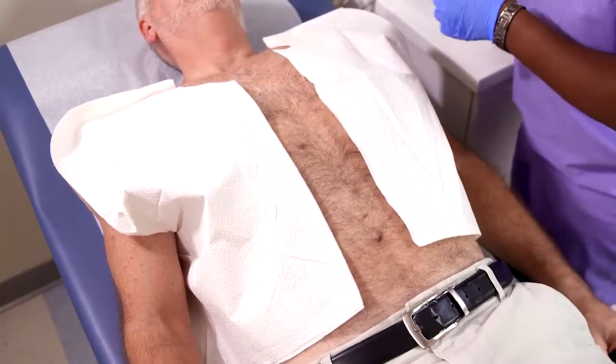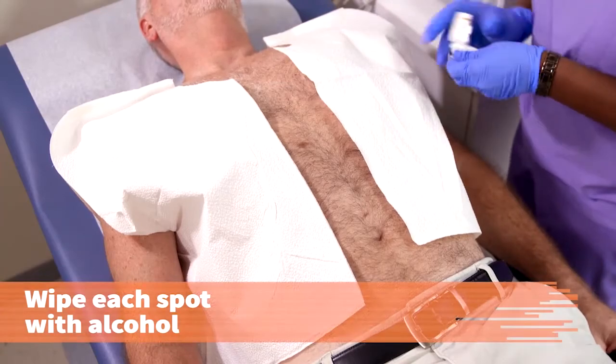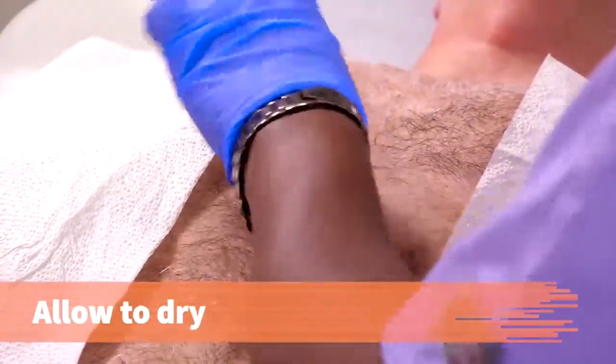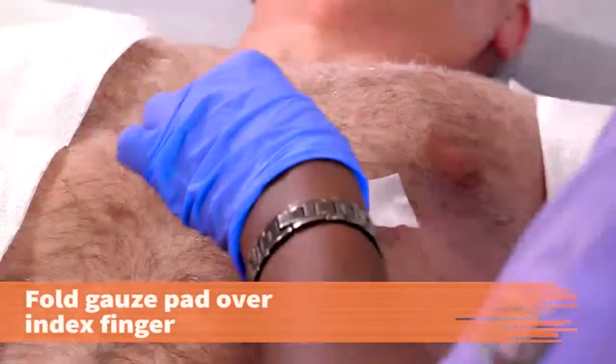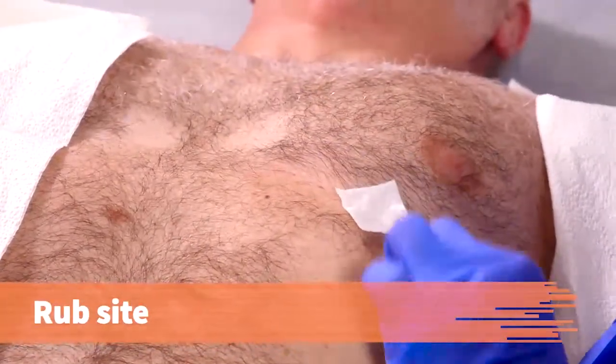I'm going to go ahead and clean you first. You will need to clean the areas with an alcohol wipe before shaving. Wipe each spot with alcohol and allow it to dry. You can use each wipe on three to four spots. Fold a gauze pad over your index finger and briskly rub the site to abrade the skin.